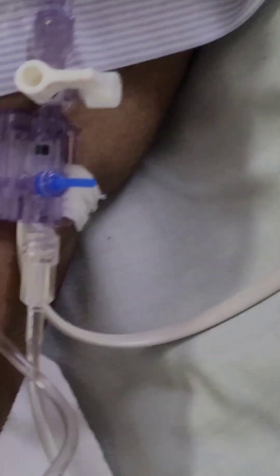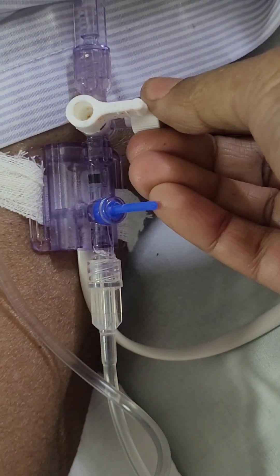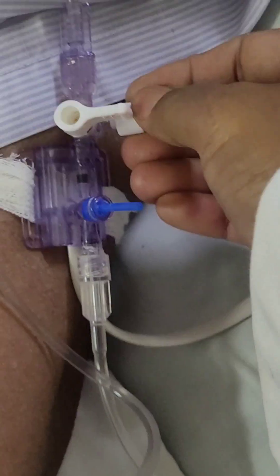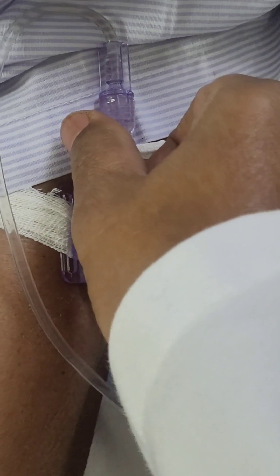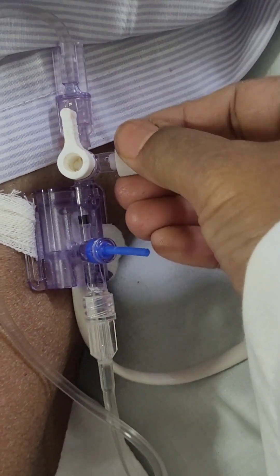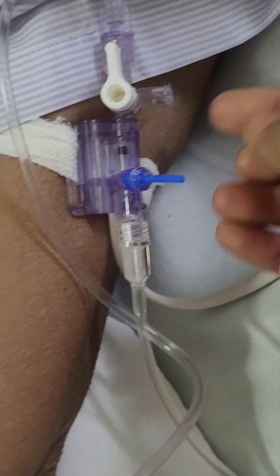To do the zeroing, you have to open this port. Before opening it, you have to close the patient end — the upper one is the patient end — so I have closed the patient end. Now the atmospheric end is open; I have opened the atmospheric end.